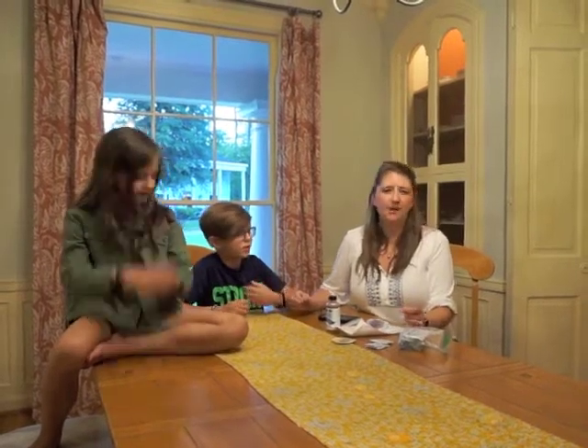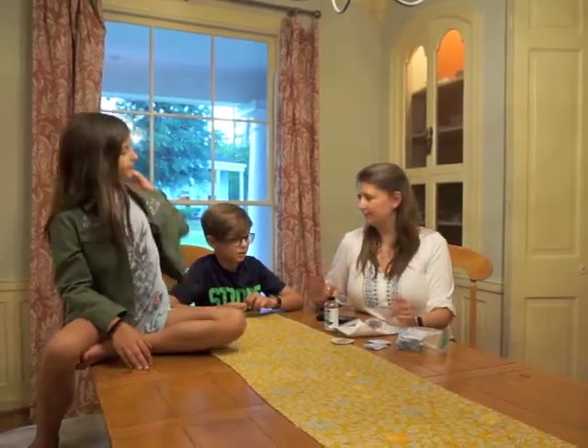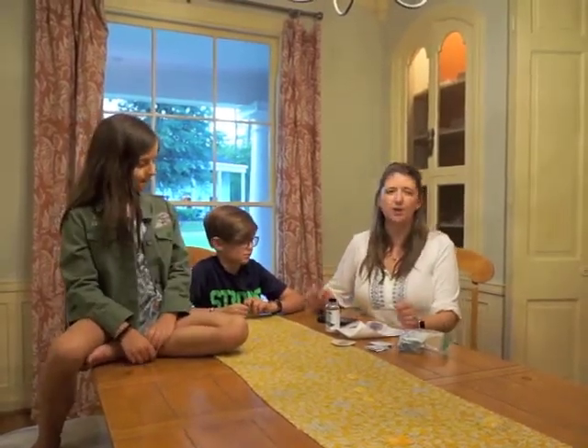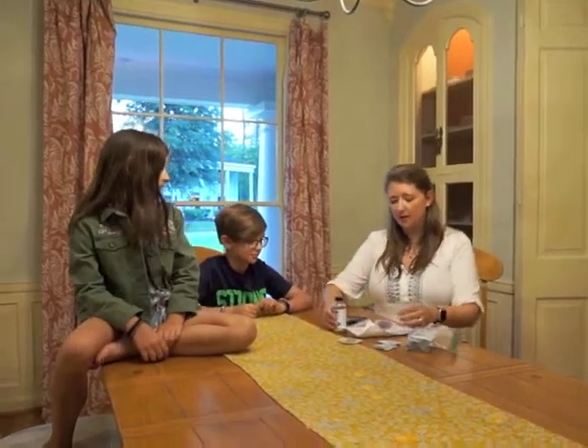He still has to prick his fingers, usually about three times a day, but it's much easier. We like knowing what his blood sugar is at all times of the day, so we're going to show you how he puts one on.